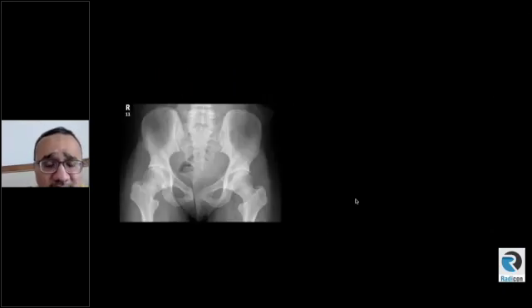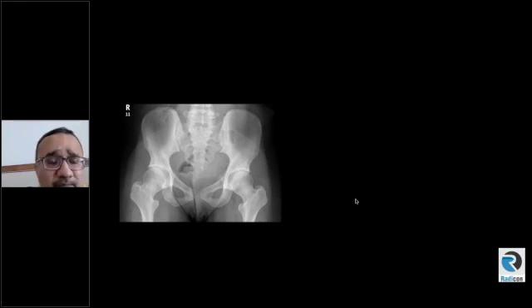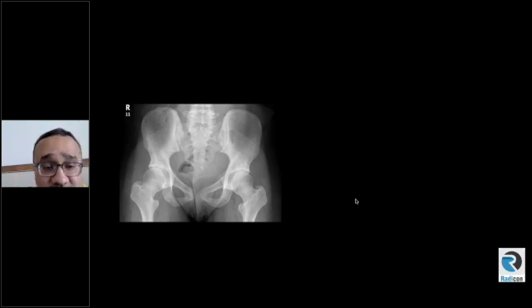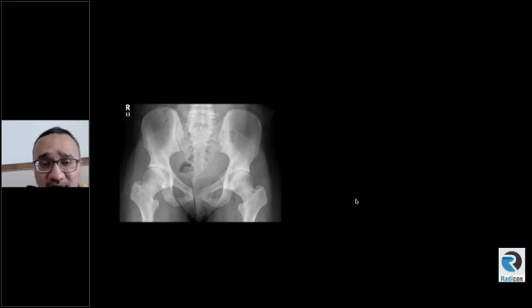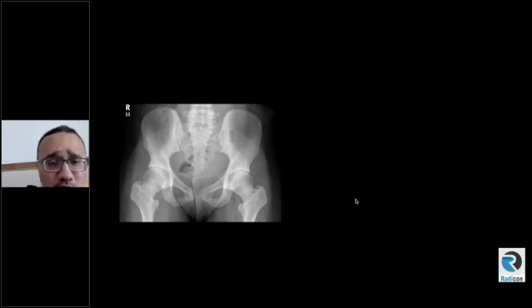This is a normal AP radiograph of an adult female demonstrating smooth, symmetrical contours of the sacroiliac joint spaces. For the clever ones, you can look at the acetabuli and see there is a figure-of-eight crossover sign. It's unlikely they're going to show this in the exam, but this film shows the normal appearances of the sacroiliac joint.